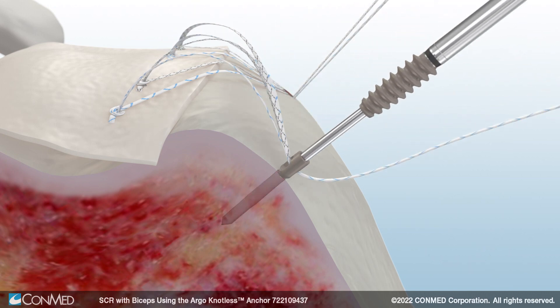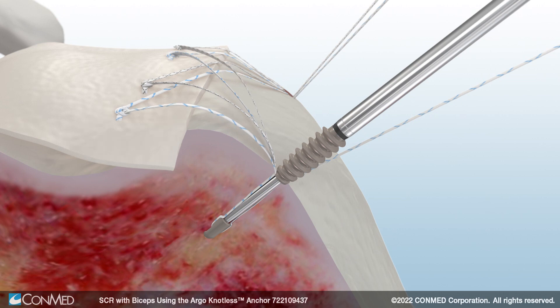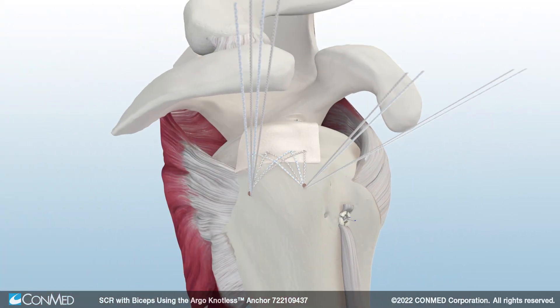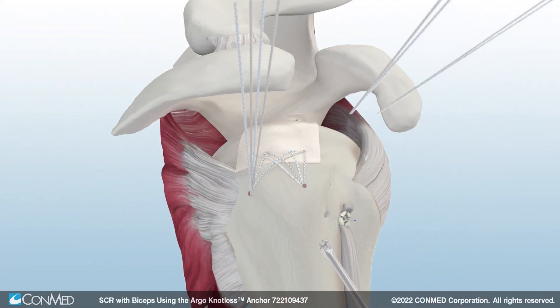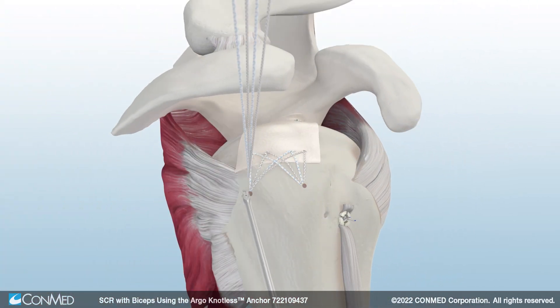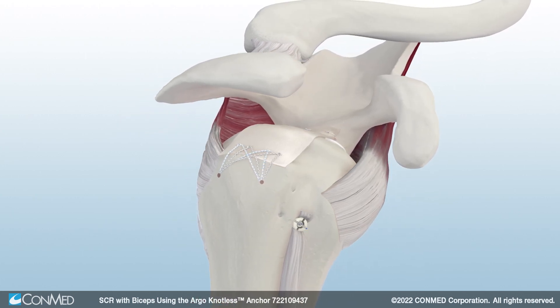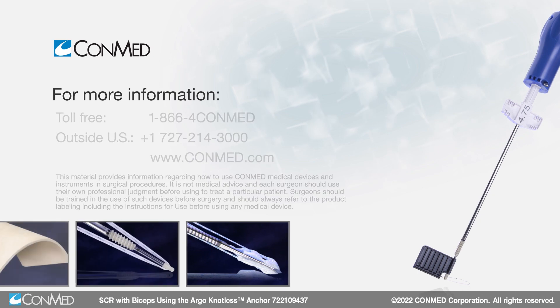The extended peak eyelet helps reduce the risk of pilot hole misalignment while the vented design may promote bony ingrowth. Finally, cut the suture tails to complete the repair. As an option, free suture can be passed through the surrounding cuff tissue and allograft to provide more coverage over the humeral head and link the allograft to the remnant cuff.